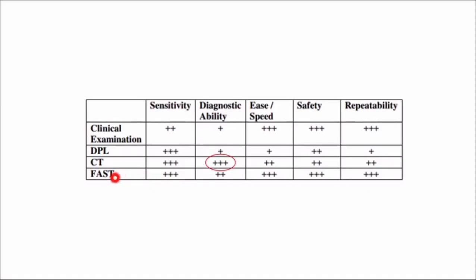That's why FAST examination is commonly being considered as the procedure of choice for emergency room evaluation of free intra-abdominal or pericardial fluid collections.